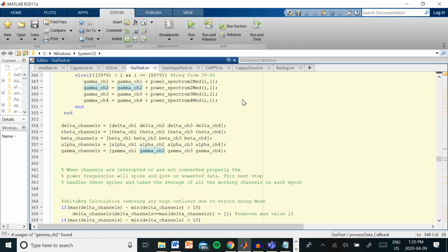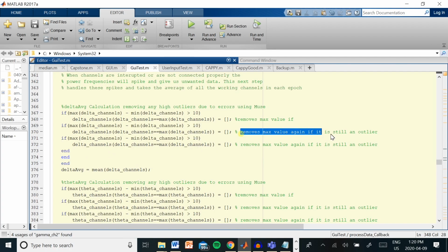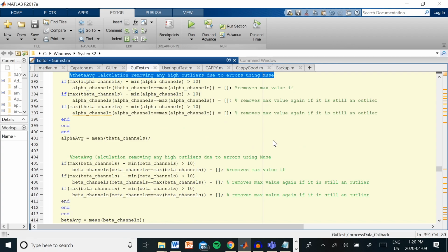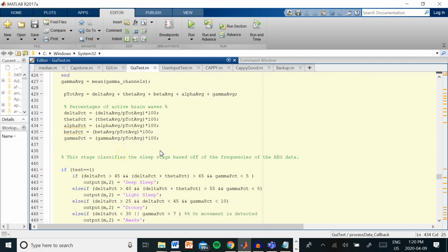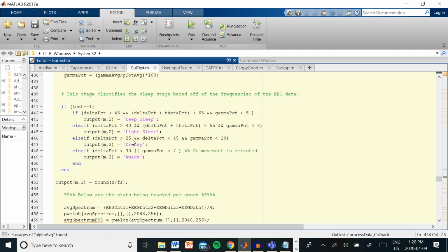Once these values are attained for each channel, we do an analysis and remove any channels that are deemed inaccurate. This was necessary because the Muse does not always stay tight to the user when lying down, causing some channels to lose proper connection and give poor results. The total percents of each brain wave measured are determined and used to classify the sleep stage. Based on the percentages, we can classify the user's state as awake, drowsy, light sleep, or deep sleep for that epoch.